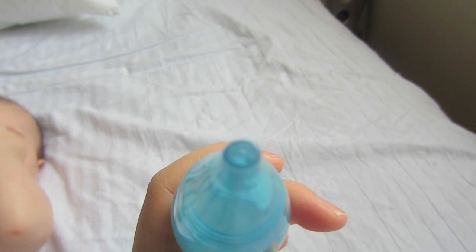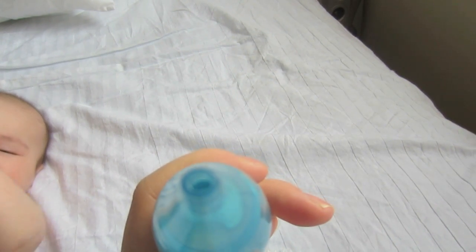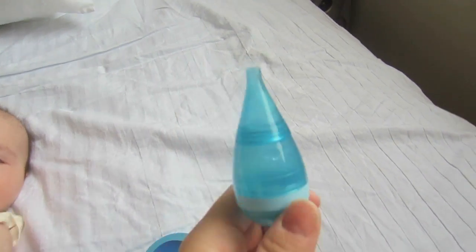Now this is oval shaped — it's not circular — so it's shaped to your baby's nostril passageway, which I love.